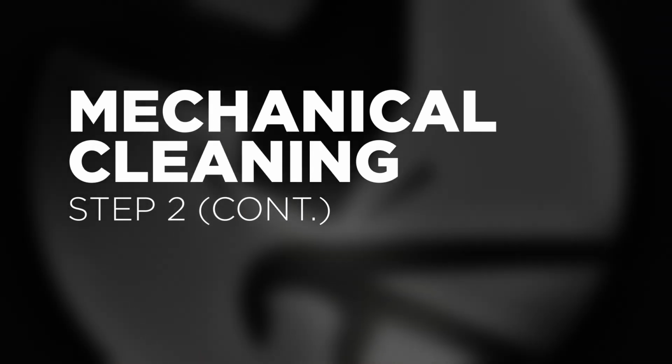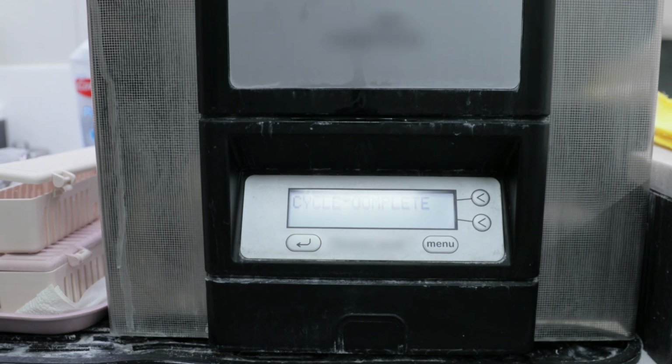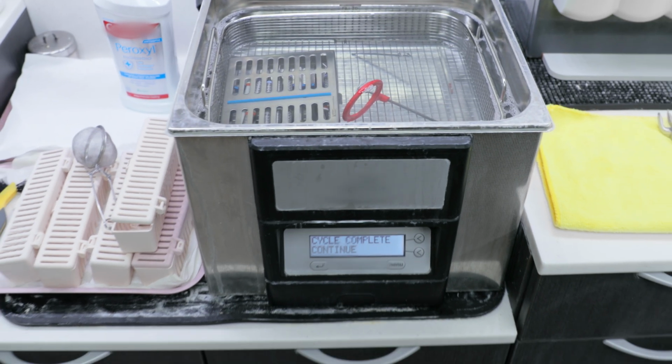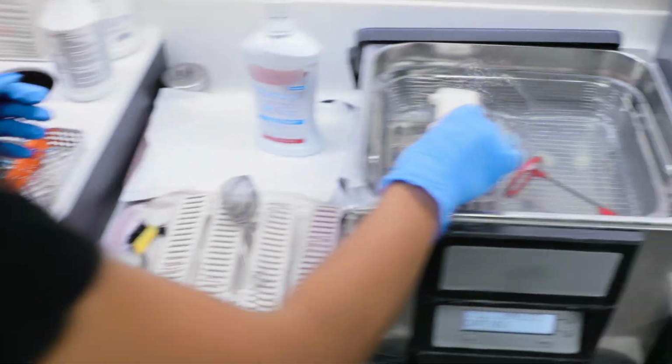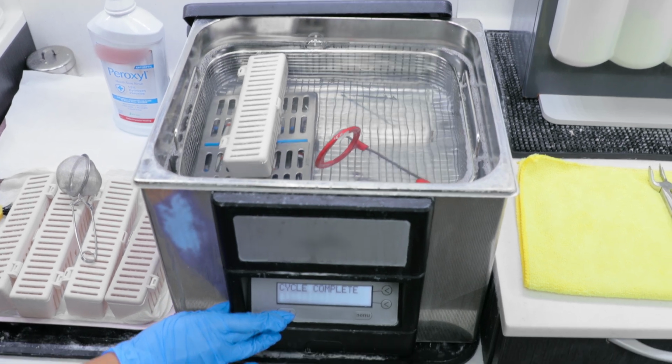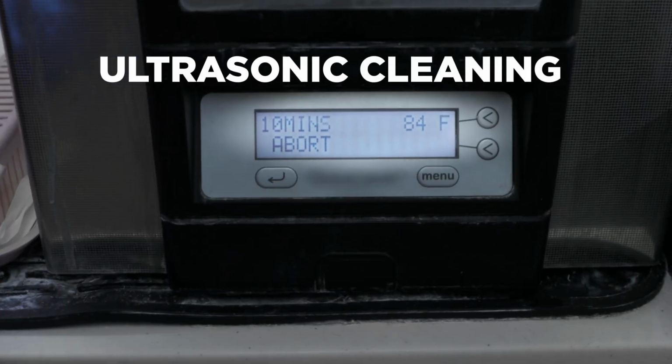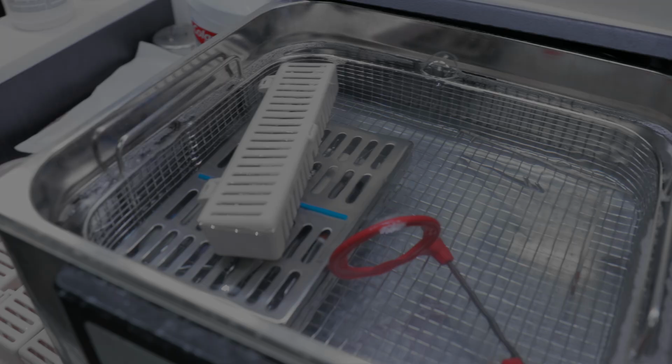The other cleaning method is using an ultrasonic bath. We highly recommend ultrasonic cleaning since it is great at cleaning microscopic particles that are protected by the texture of a surface or designed features like hinges and cannot be cleaned by manual processing. Ultrasonic cleaning should not exceed 15 minutes.